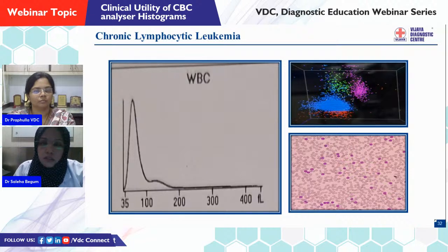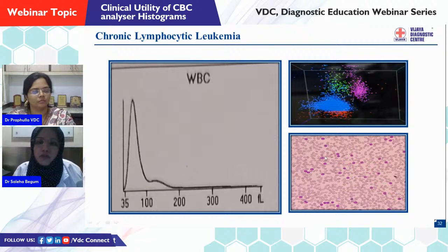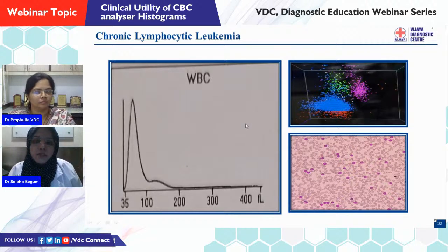So here in this slide, you can see a graph which is having only a left curve that is corresponding to small lymphocytes on the peripheral smear and an increased blue cell population in a scatter plot. So if we see the histogram in conjunction with the scattergram and peripheral smear, a more clear picture we can get.